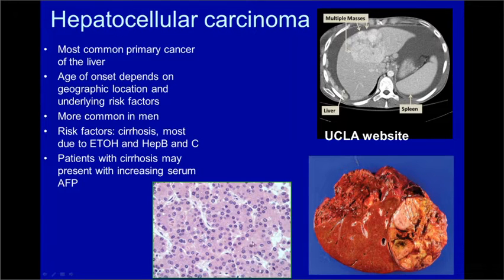And then over here is the characteristic histopathology, which shows widened trabeculae. The cells appear to be hepatocytes. We can recognize them by the abundant granular cytoplasm and the centrally located nuclei, but it's not your normal architecture anymore. We have widened trabeculae, and here we can see that they're surrounded by endothelial cells.